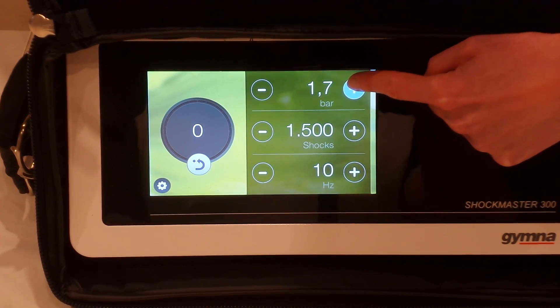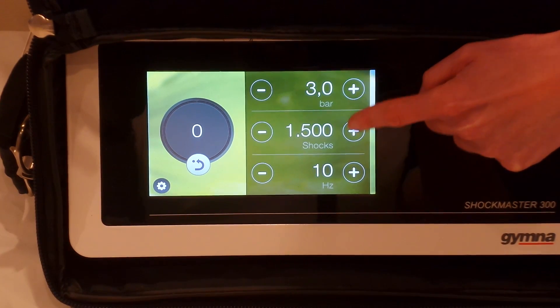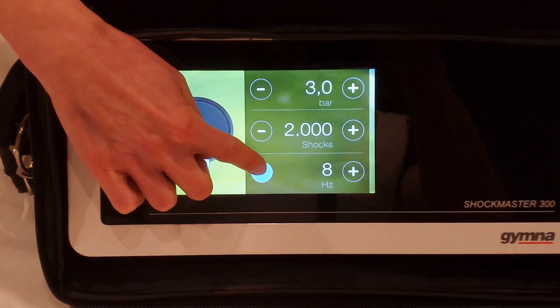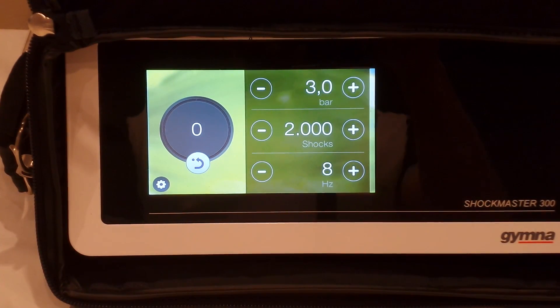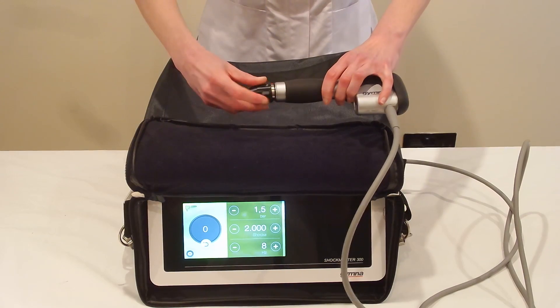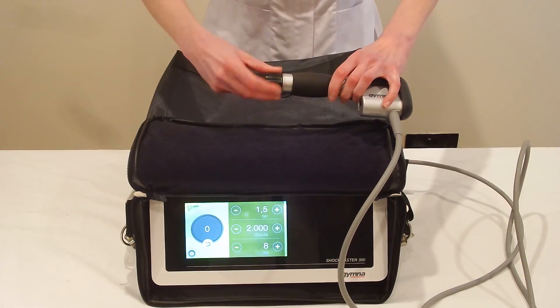In our first video on the hamstrings, we'll be treating scar tissue in the Semi-Membranosis, Semi-Tendinosis, Medial Hamstring Complex. We're going to go to 3 bar, 2000 shocks at 8 Hertz — we're trying to destroy some scar tissue. We're going to use a 15 millimeter convex head, not the concave head, which would go too deep.